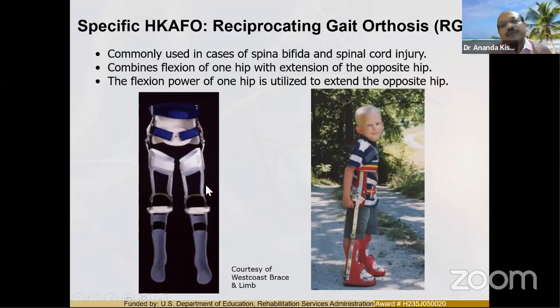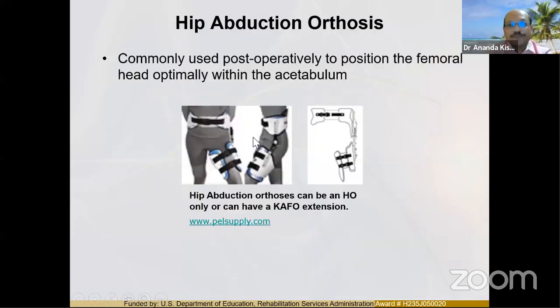There are some other varieties like the parapodium. Parapodium is another alternative for this. I'm not going into detail, so that's just so you can understand. If both limbs are paraplegic, in those patients you can use either this HKAFO or the LS HKAFO or the parapodium.